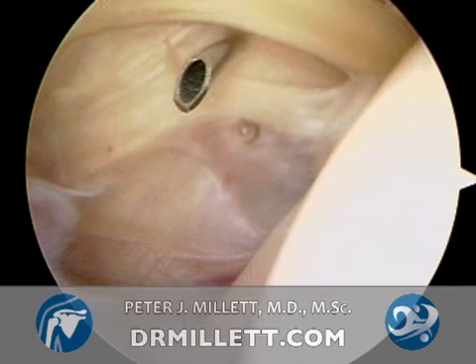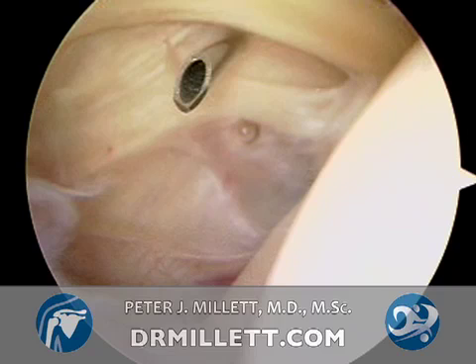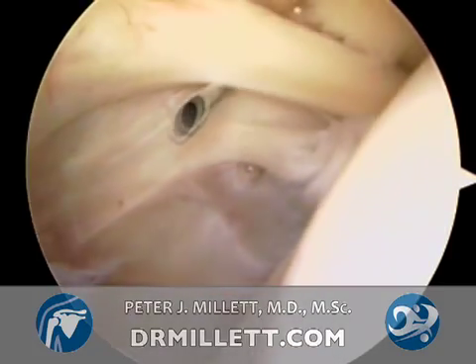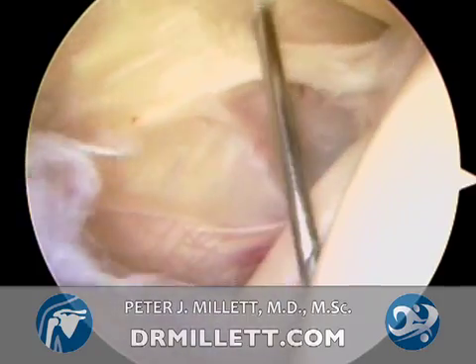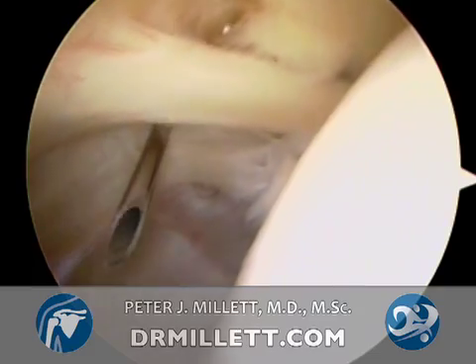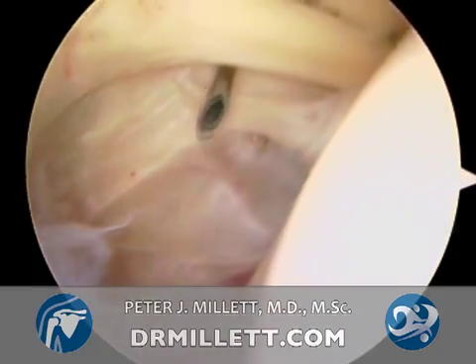A rotator interval closure may be performed in either a beach chair or lateral decubitus position. Here the rotator interval is visualized from the posterior portal in a left shoulder of a patient with multidirectional shoulder instability. A patulous and thin anterior capsule is visualized. A spinal needle is used to approximate a standard anterior arthroscopic portal through the rotator interval. The arm is then externally rotated approximately 30 degrees to minimize external rotation contractures, and a cannula is positioned just outside the joint capsule.